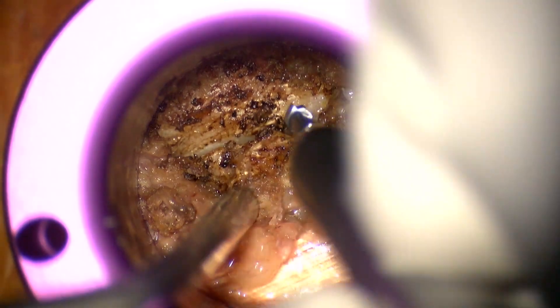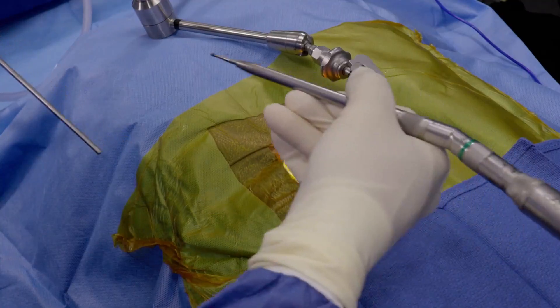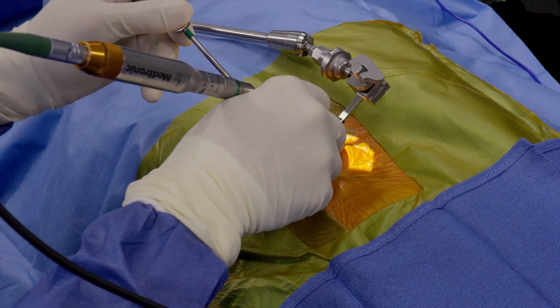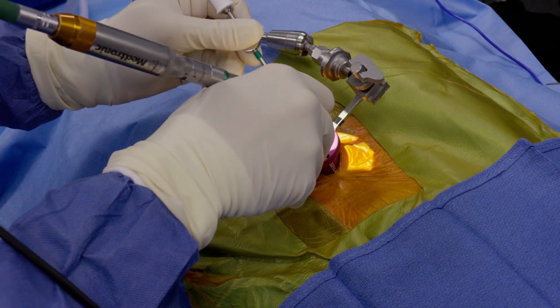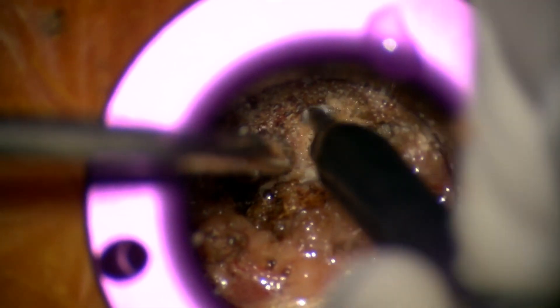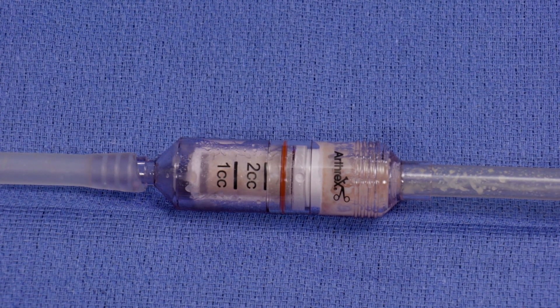Standard MIS type T-LIFT, facet joint exposed, caudal-cephalad — foot to head. We have our standard high-speed drill with a three millimeter match head that has two flutes, which helps maximize our bone graft cell viability. Harvesting with fewer and larger flutes allows you to see the size of the bone graft coming off, as opposed to using a multi-fluted burr that turns your bone more to dust. This leaves larger pieces that get harvested and ultimately lead to higher cell viability in your collection.